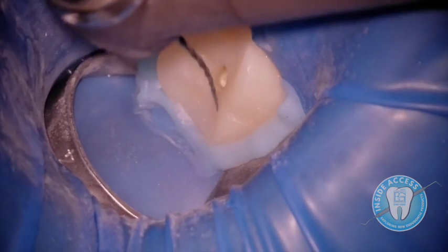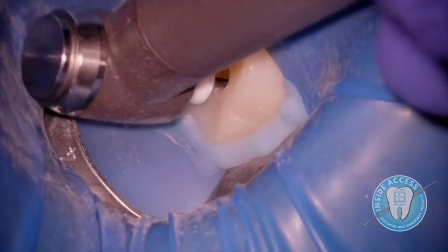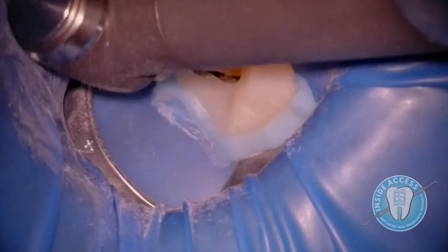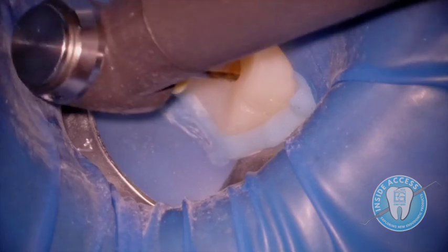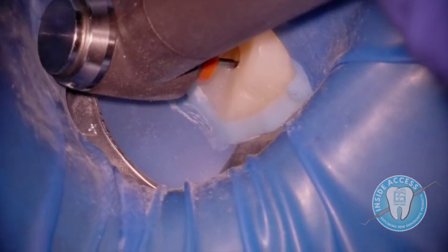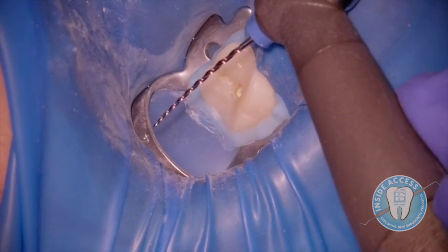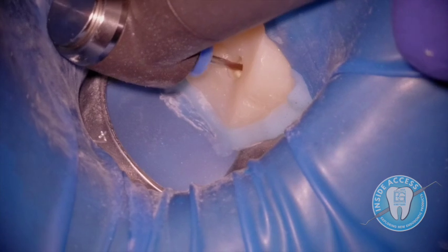Now the S2 at 18/04, going in and engaging any GP on the walls — it's starting to come off, but now we're really back to normal instrumentation. Always irrigating in between. Here's F1 at 20/06, starting to enlarge. Then F2 at 25/06, continuing to shape the canal and remove the GP. The prior root filling was likely larger, so we'll carry through the whole system.